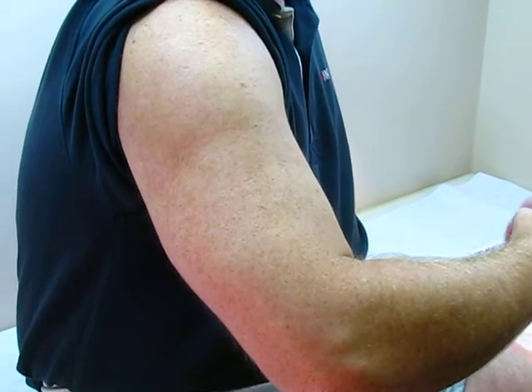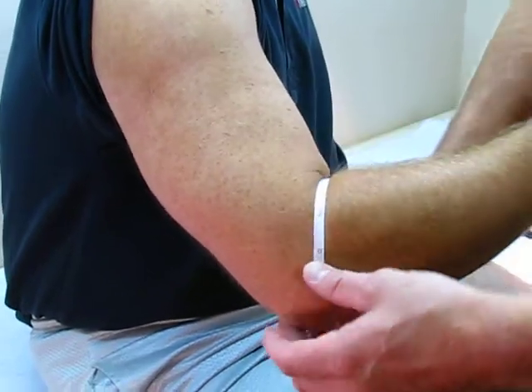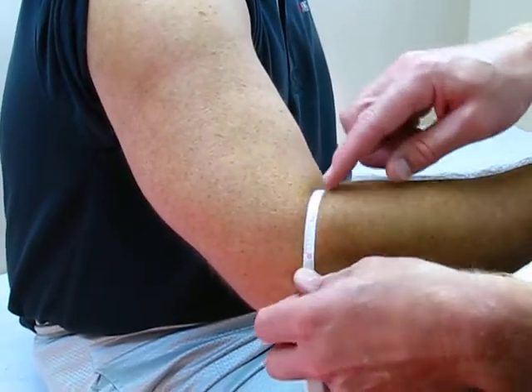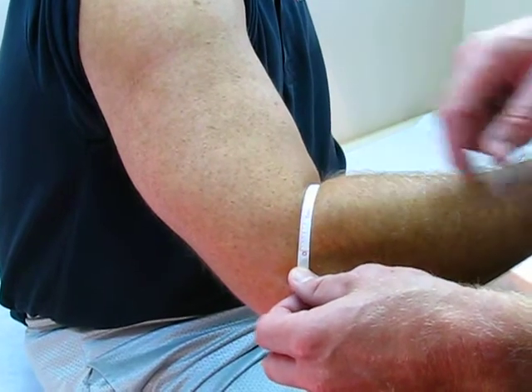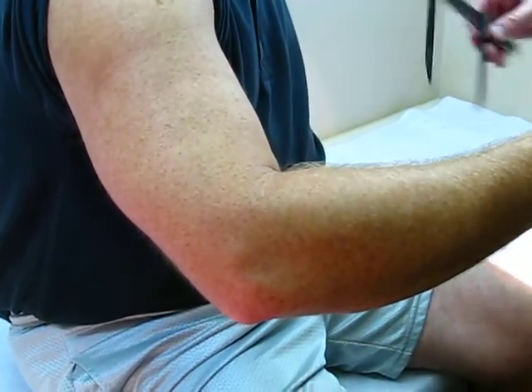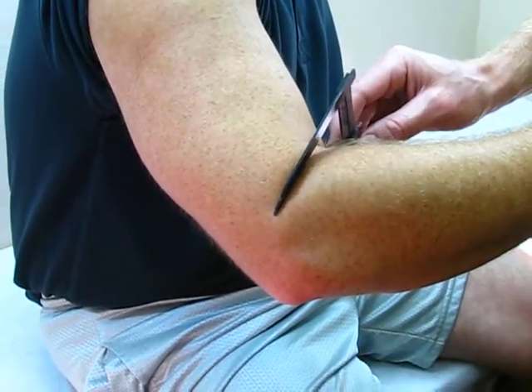Next, for measurement B, we're going to do a circumference at the elbow joint. Take that circumference, making sure our tape is snug and flush on the skin. And then we're also going to take a medial lateral measurement of the elbow as well.